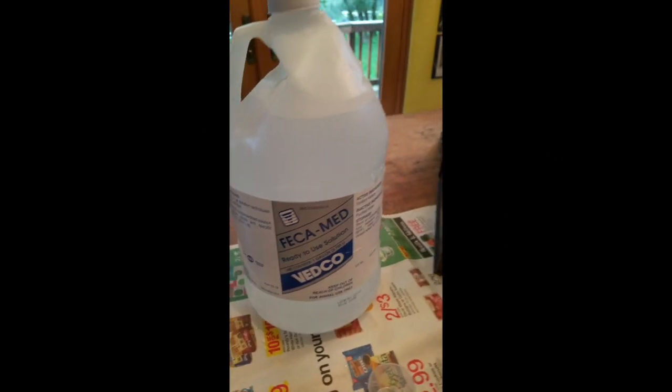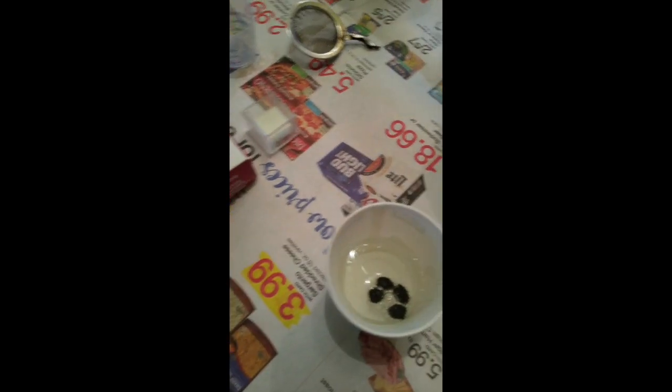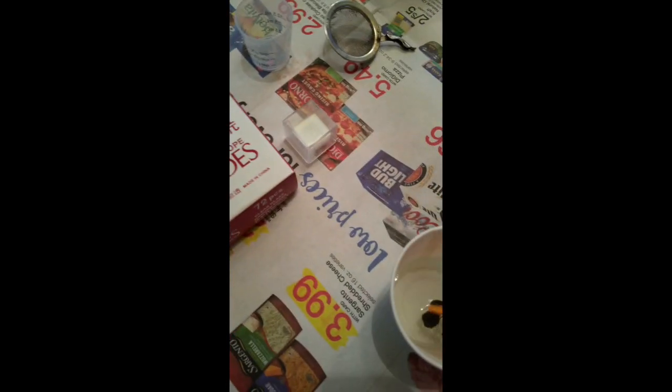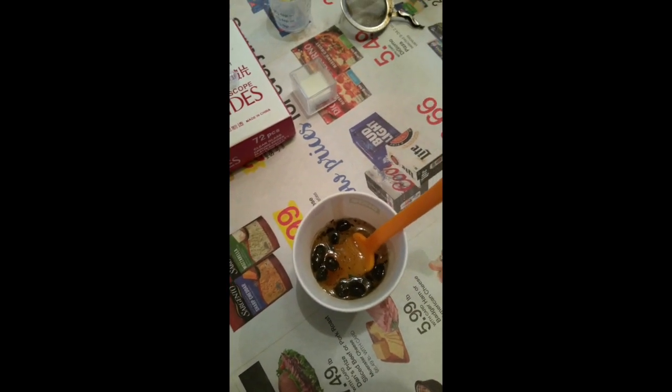I'm going to put in here - open her up. I'll take my little Shrek glass, put a couple little guys in there. Then I'm going to pour the fecal solution into this cup. Then I'm going to mush, mush, mush - you can see I've been mushing, I still have a lot more to mush.